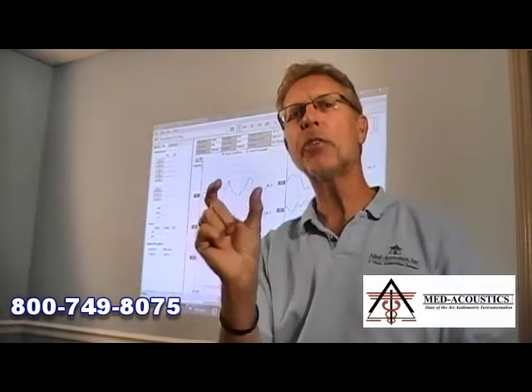One of the other features of the Eclipse is that every time you run a wave, two waves are actually collected. And what you see is the average of both of them. Okay? So an A and B is collected simultaneously. You almost never have to do a replication run. Audiologists are used to running replications for every single run they run on an ABR.